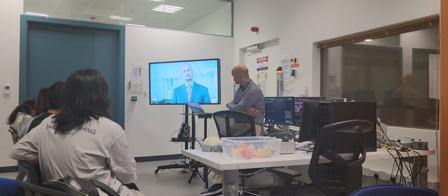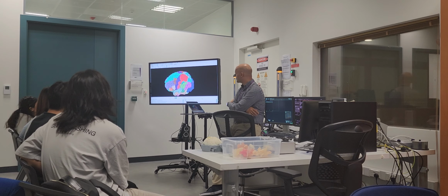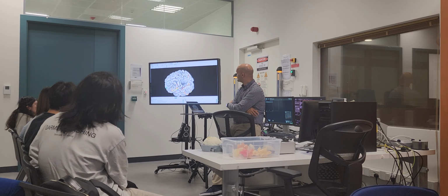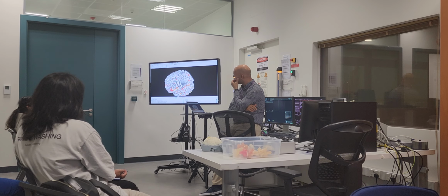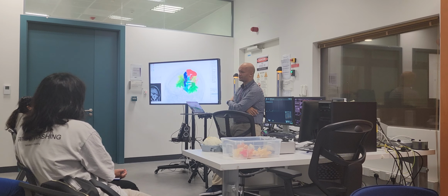The second modality that we added was actually functional MRI, where we asked the patient to conduct specific tasks inside the MRI scanner. For example, complete a sentence or generate language tasks, or generate a verb, and so on and so forth. And those areas were lit up in the MRI scanner to help the surgeon identify the so-called eloquent cortex, and to show the connectivity between these cortical areas or functional areas, so the white matter to the rest of the brain.